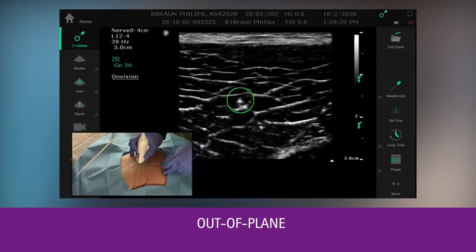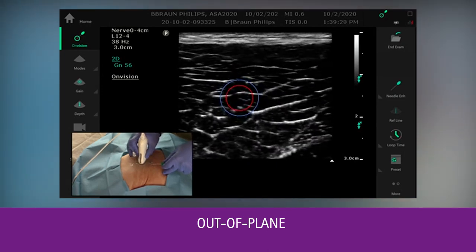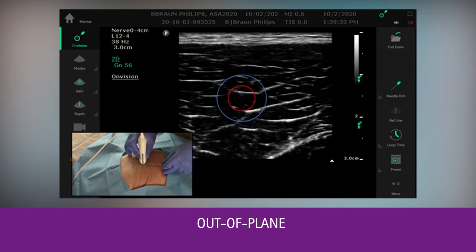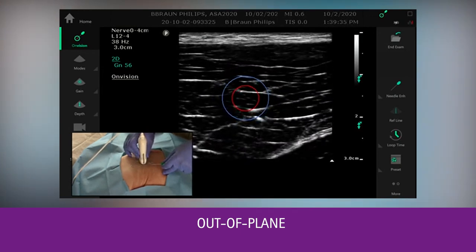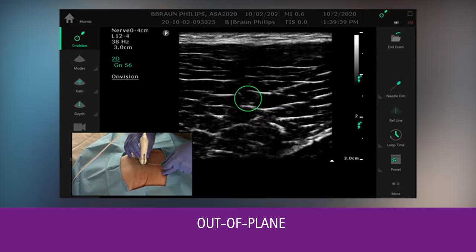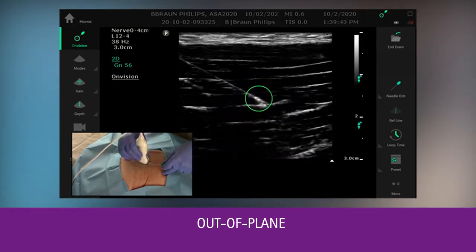At this point, we are completely aligned with the ultrasound plane and the needle tip. This benefit allows multiple insertion angles and still be able to identify the needle tip. The blue and red circle will help you to align the needle shaft and the ultrasound plane.